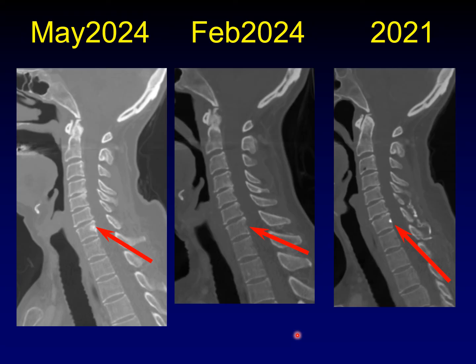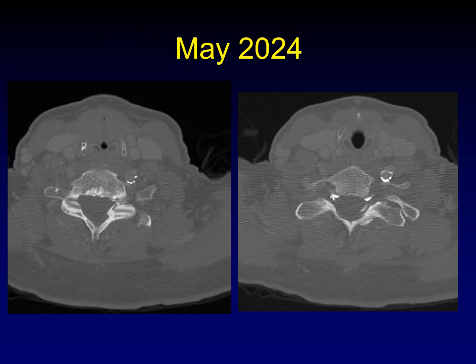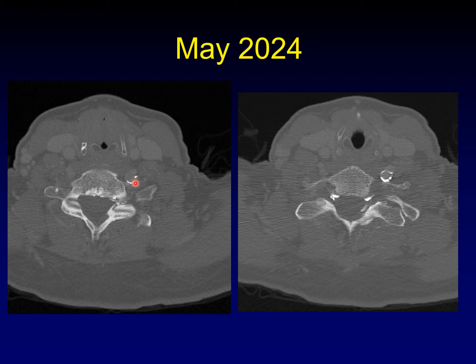We uncovered an additional examination from three years earlier, and there's a very interesting finding at that location — super dense material. This is undiluted refluxed contrast that is coming up through the venous system. And if you were super perceptive, you might have noticed the undiluted contrast refluxing into the vertebral veins even on the initial image. Looking at an image just further superiorly, you can see these veins more clearly with their undiluted contrast.